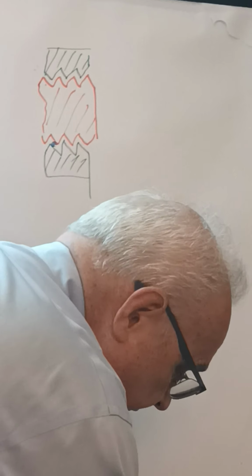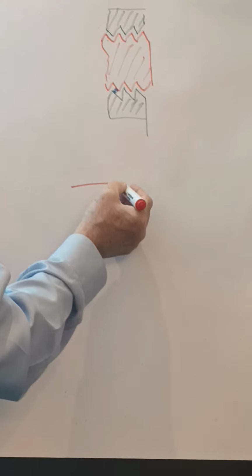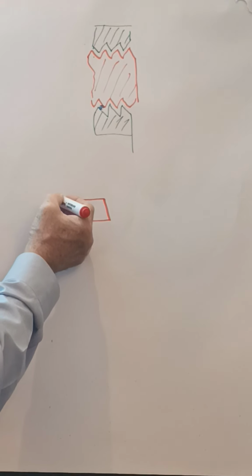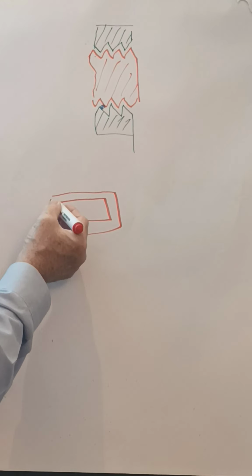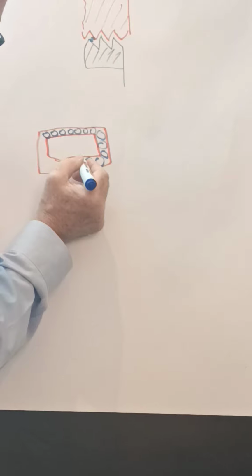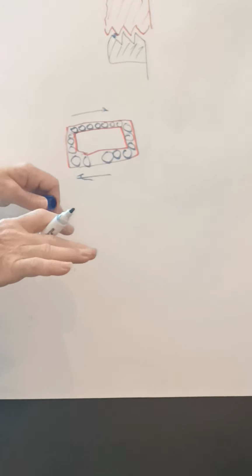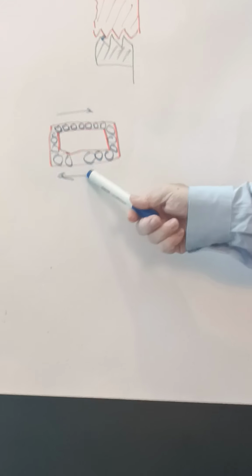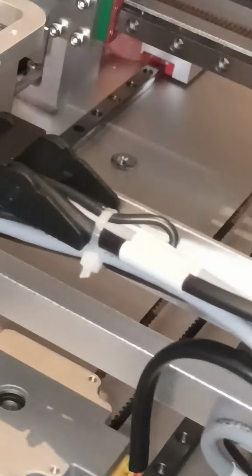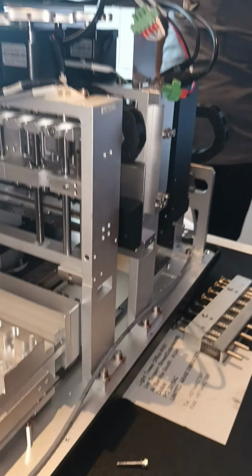For the linear movement, you have the linear bearing, which consists of the shell, and we have a groove. Inside of this groove, it would not wobble when you're moving it. So this one, for the incubator movement, we have all those. So those are the linear bearings. And inside of it, between the rails, are those balls that I showed to you. When you're moving it, they start to rotate, eliminating all the gaps, dead zones.